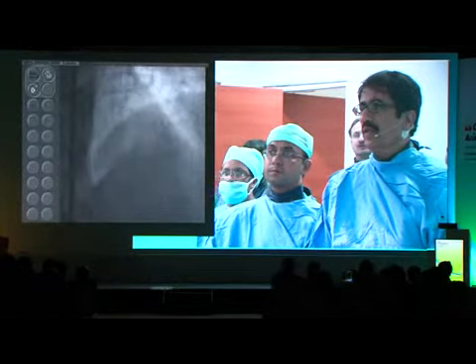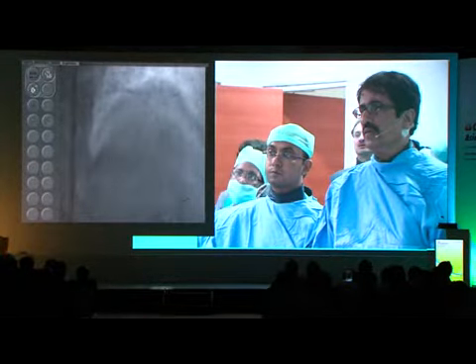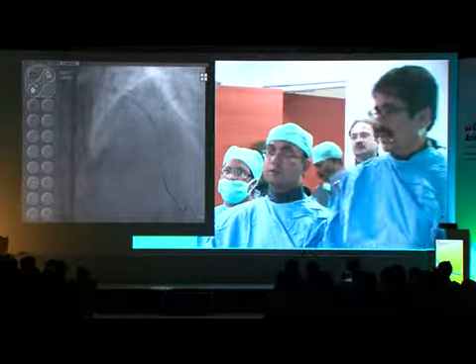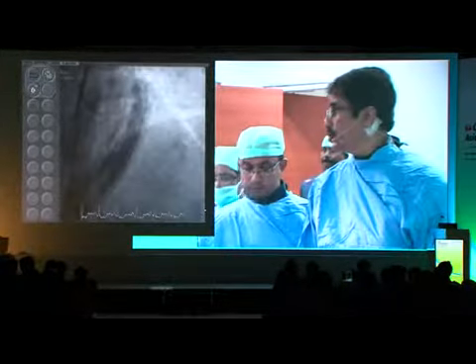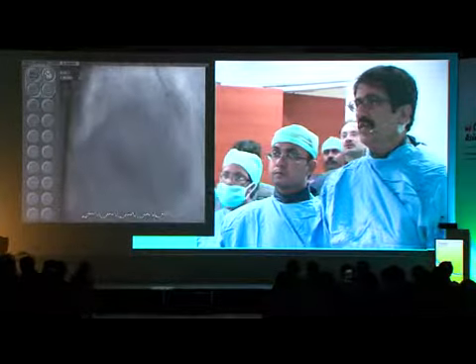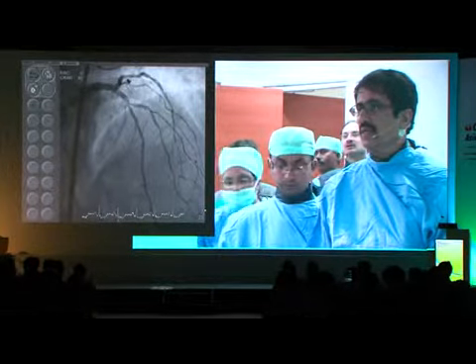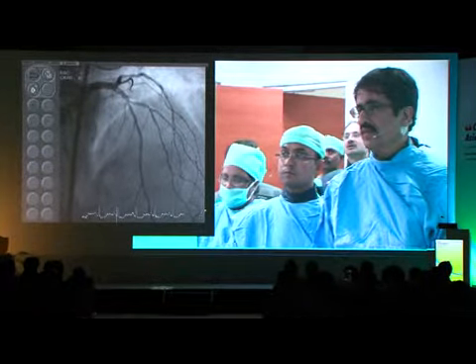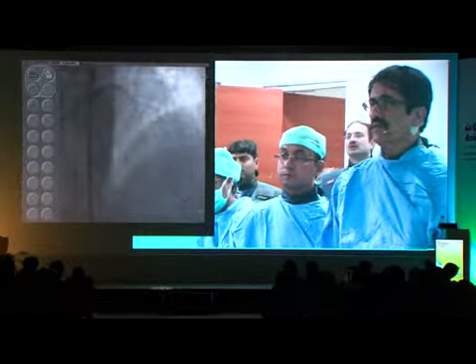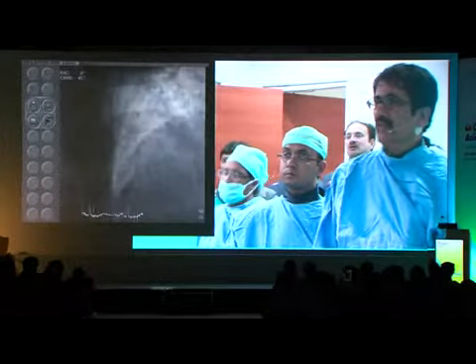Okay, what have you done till now? Distal diagonal. After the stenting of the diagonal, what have you done? We show run number 2 again. See, this is the pre-procedure, and the mid-diagonal looks diseased over a long length. Show the last one after the stent, before this. Okay, run this. No, show the zoom.